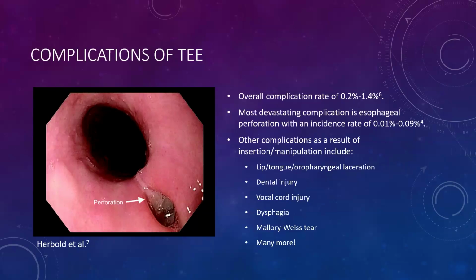If you guys have ever seen someone with an esophageal perforation, they tend to develop mediastinitis, which can be extraordinarily deadly. So the overall complication rate of TEE is very low. And recall that this includes a lot of outpatient TEE, so some huge numbers there. And awake patients tend to fight a little bit more.